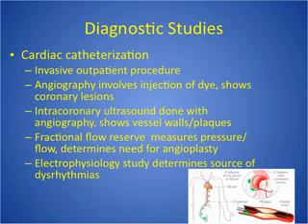They look at those dysrhythmias. So as you can imagine, there are complications with this procedure and risks, particularly bleeding or hematoma where they put that catheter in. They could have an allergic reaction to the dyes. Of course, everything has a risk of infection, but it isn't particularly high risk. Clots. So not only can you risk bleeding, you can risk getting a clot in that same part where they put it in. Some very serious things that could happen are a dissection of the aorta, and dysrhythmias, because you've got that wire up in their heart and you might touch the side of the heart wall and stimulate a dysrhythmia.